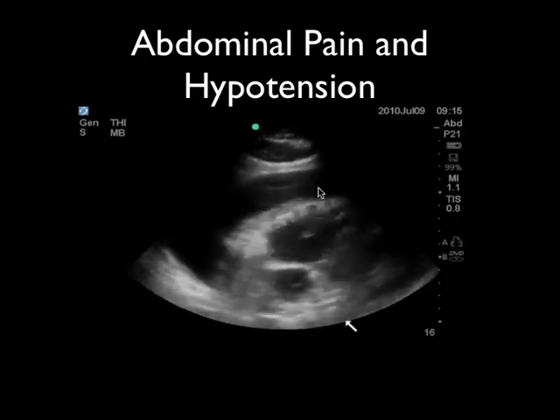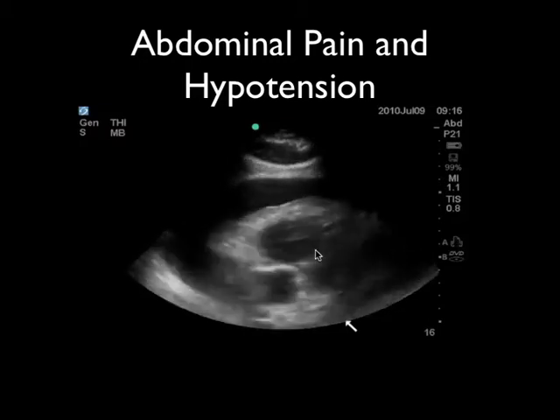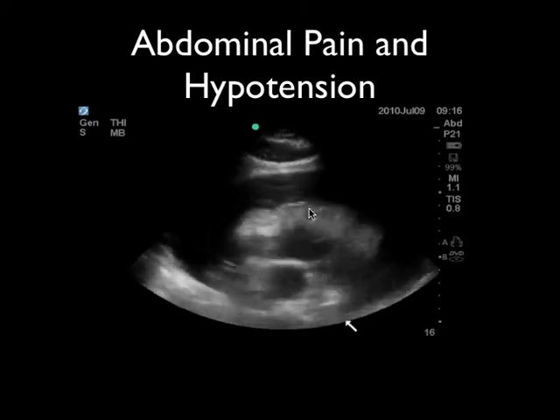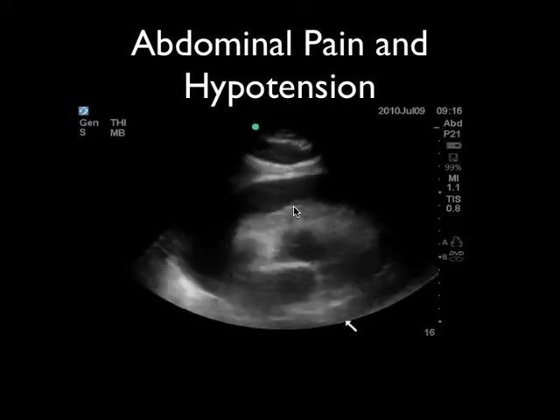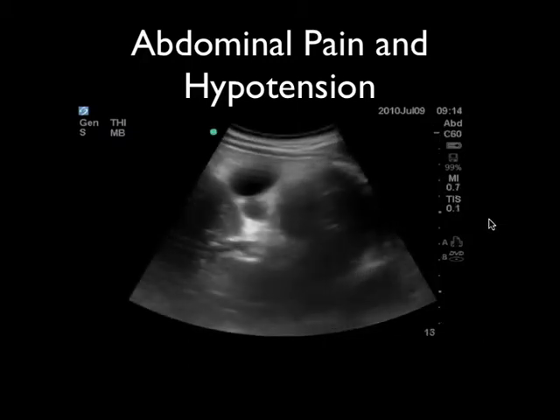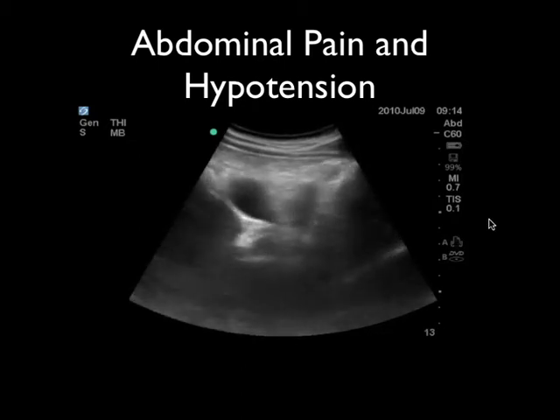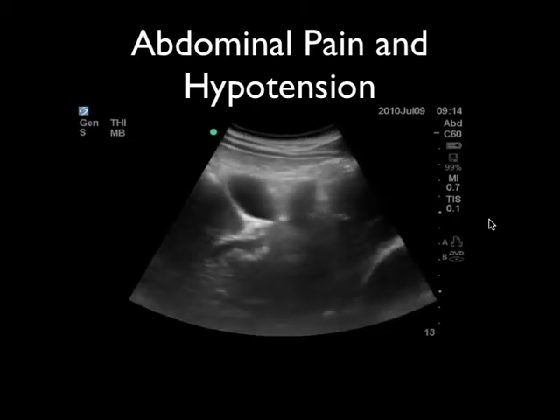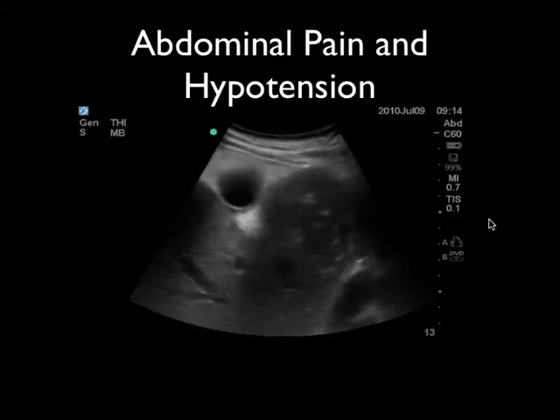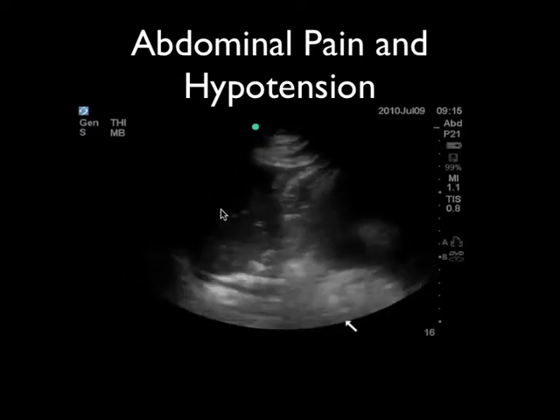and it's hard to tell from this particular view whether there's really tamponade physiology going on here, but in the setting of a patient with at least a 2 centimeter pericardial stripe here who's hypotensive, and when we got a little bit better history, when we controlled his symptoms, yeah, maybe he was a little bit more short of breath than he had abdominal pain. What started out as abdominal pain turned out to really be more shortness of breath, and that's just the nature of emergency medicine. We only have so much data, but certainly here's that liver over here.